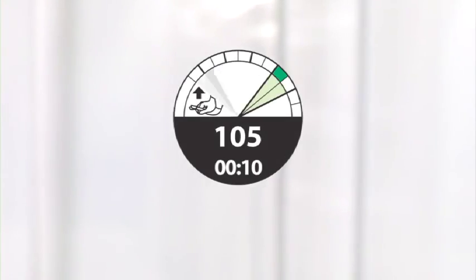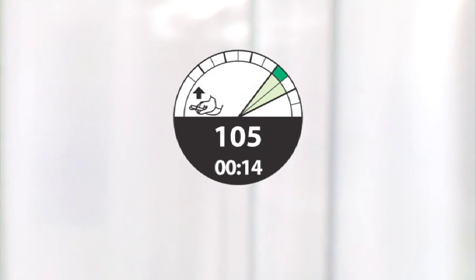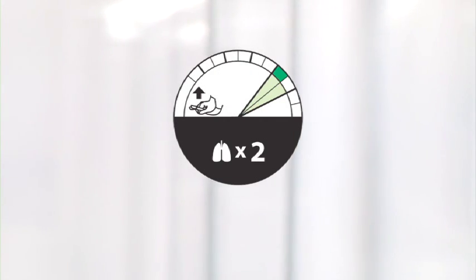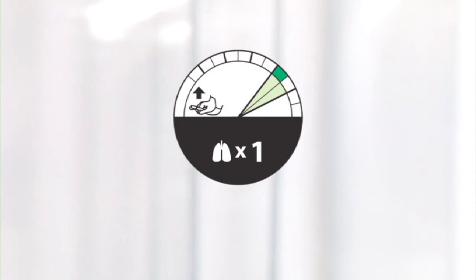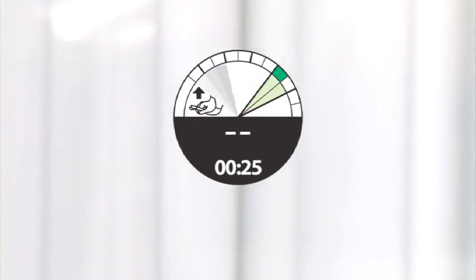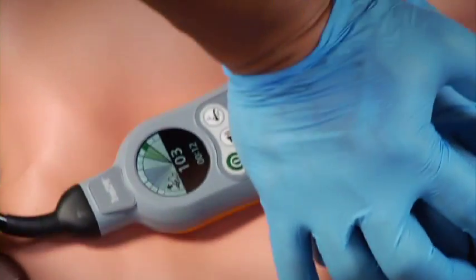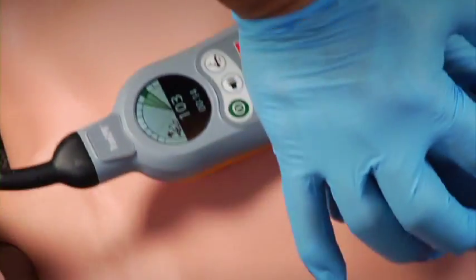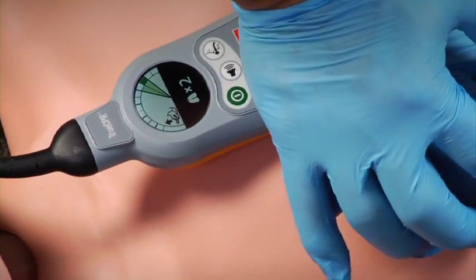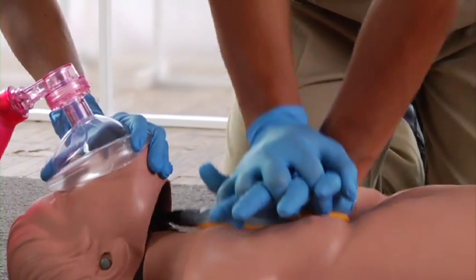TrueCPR will count you down to rescue breaths: three short tones to get ready, then two long tones when you should give breaths. Immediately resume chest compressions afterward.